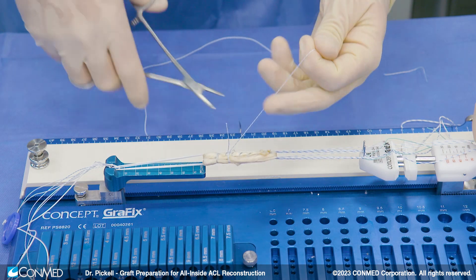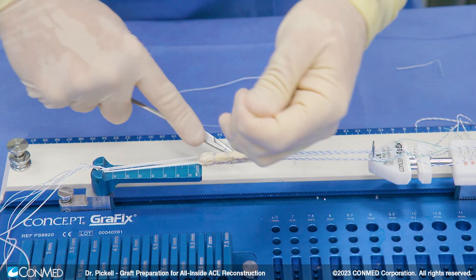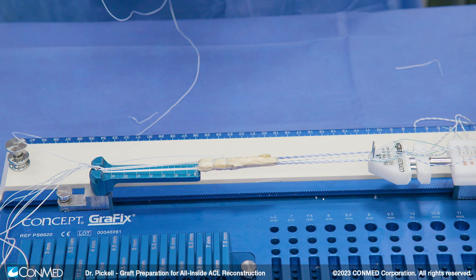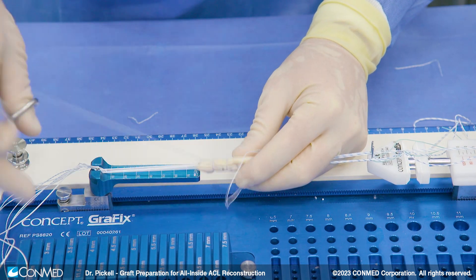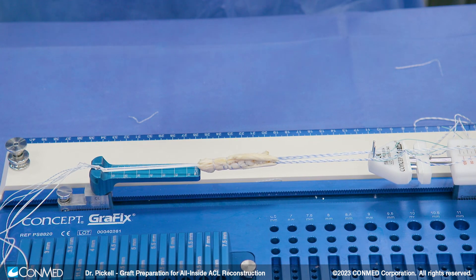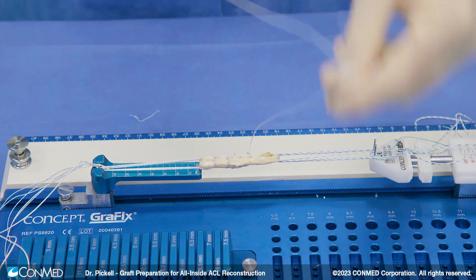One of the holdups from doing this technique is often the graft prep — it's seen as being a little bit more difficult. But as you get used to it, you'll find it really doesn't take any longer than a standard graft prep, and I think it leaves you with a nice consistent graft. The benefit to this graft preparation technique is we're only harvesting one tendon — the semitendinosus, which is the bigger of the two tendons. By quadruple wrapping the semitendinosus tendon, we're actually consistently producing a larger graft than we would if we were using the double strand of gracilis and double strand of semitendinosus, so we're ending up with a more consistently large graft — which, as we know, is important to prevent ACL failures.